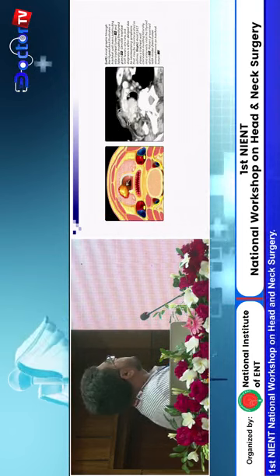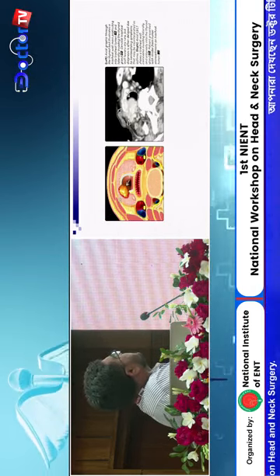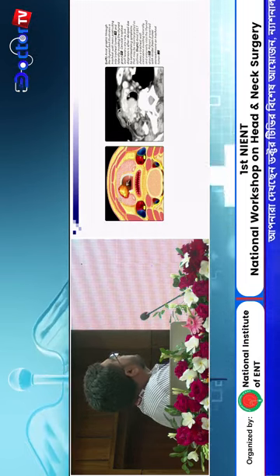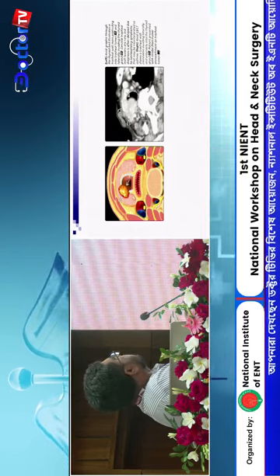Another subglottic mass, we see there is a circumferential tracheal ring. There is a mass in the right side of the tracheal wall. Also, the lesion involves the right lobe of the thyroid gland. There are some necrotic lymph nodes at level 4.